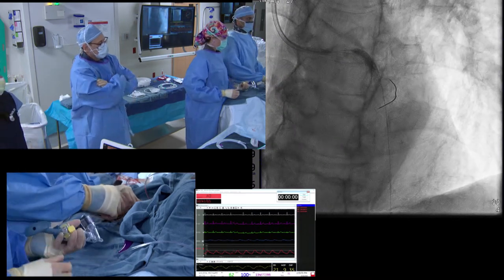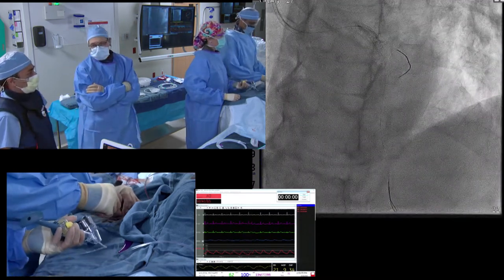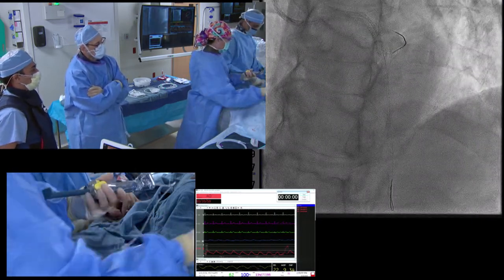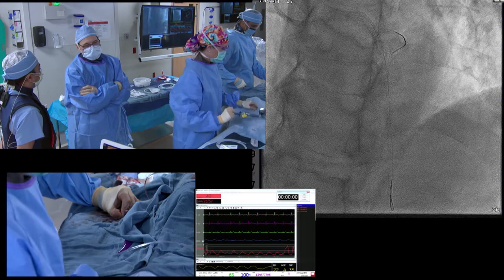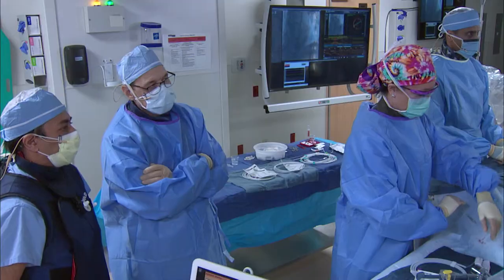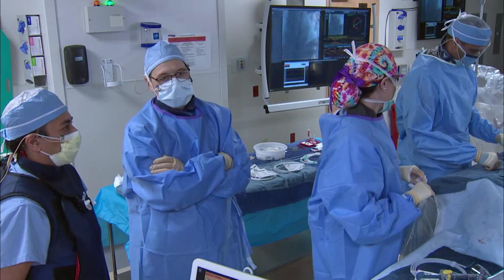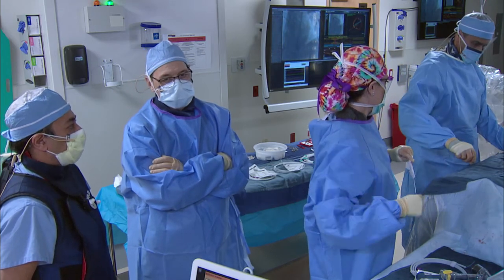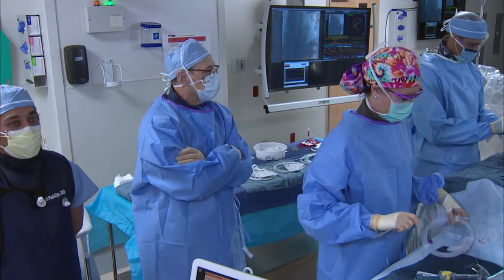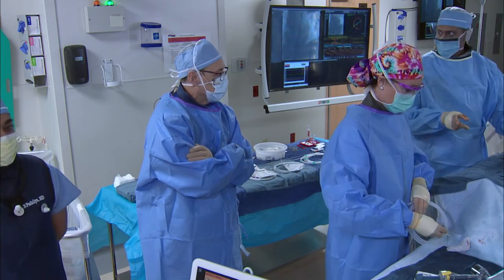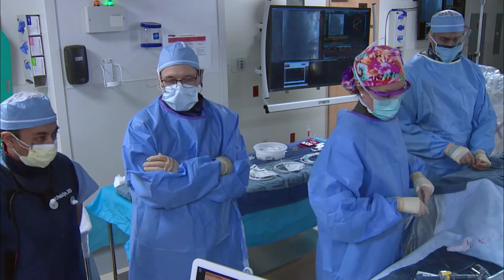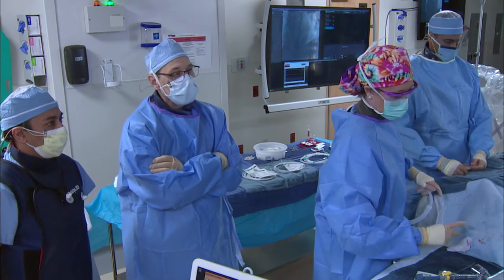The interesting thing about this case is lumen-to-lumen measurement versus media-to-media. Dr. Bezerra prefers lumen-to-lumen — if there's eccentric plaque and you over-dilate a little, you'll end up with a dissection. That strategy may lead to one or two more balloons, maybe one extra OCT run, but may be safer. The information you get from OCT allows what I'd call absolute precision PCI.